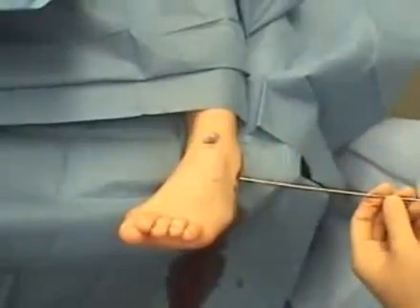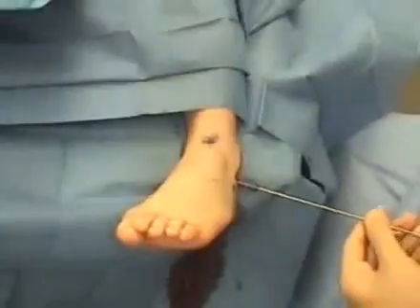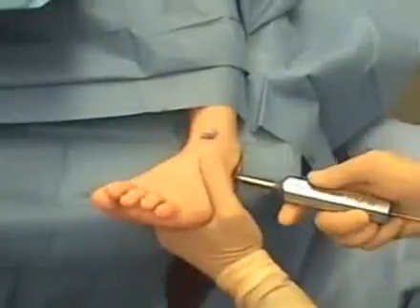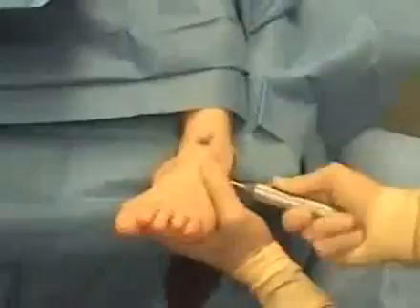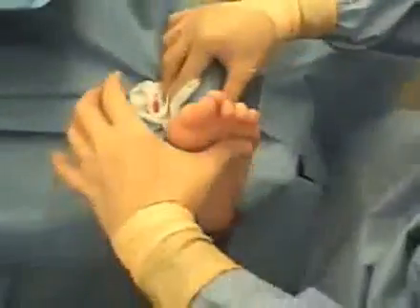So here's size 6, obviously thread end first. We have that nice angle from anterolateral distal to proximal medial posterior. We're going to get our angle, go ahead and pull the guide wire out so we don't get any problems with that, and we're just going to push that stent in until it won't go in anymore, and then just give it a couple of spins to lock it in place. That's it. We're done. Put a couple of stitches in her skin and she's all set.